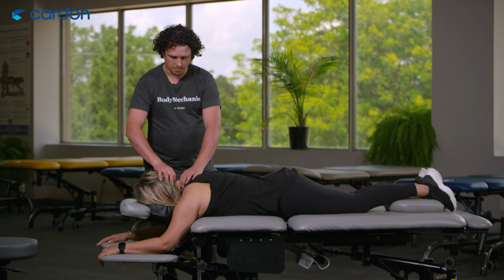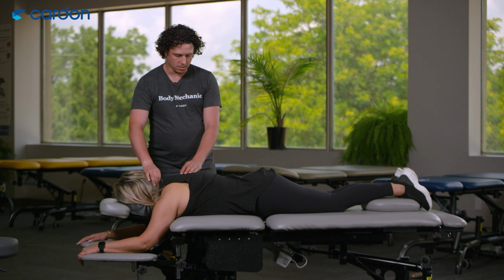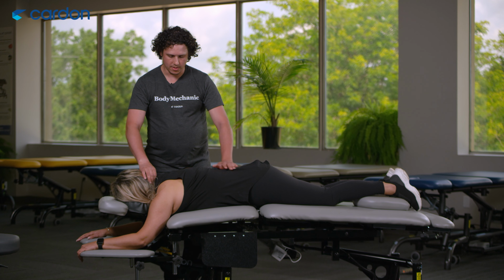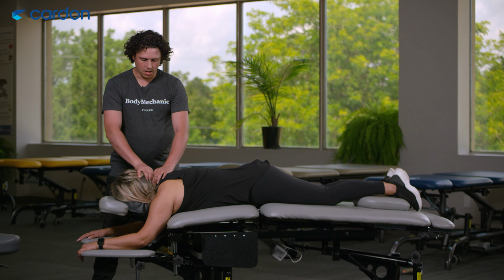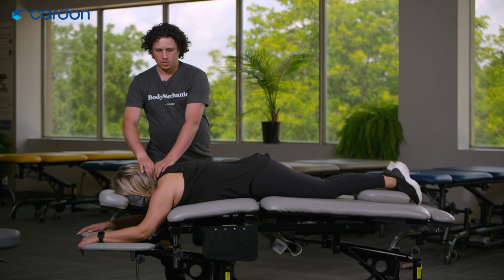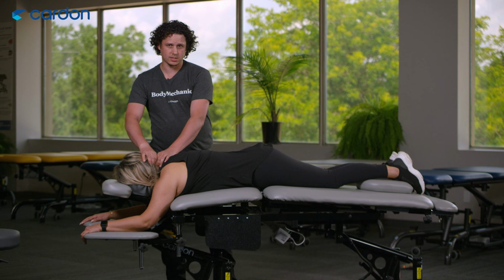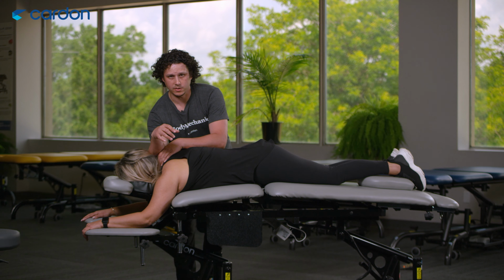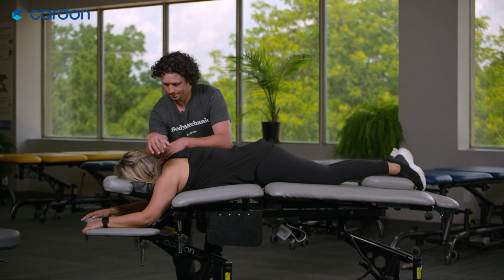Then I'm going to come down through here. We're going to raise the table in the center a bit just to get rid of the posture in the lower back and flatten that out. And then I'm going to come in here and start doing my treatment work. A lot of times we're bent over like this on the table trying to do our work. The good part of having a multi-use table is we can raise it to the proper height. Then I can come in and do more specifics, and again, I'm not hurting my back, not hurting my body.